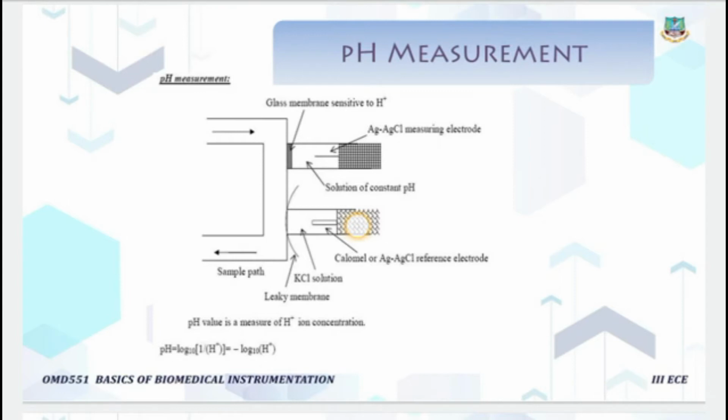Here the silver or silver chloride reference electrode is immersed in potassium chloride (KCl) solution.